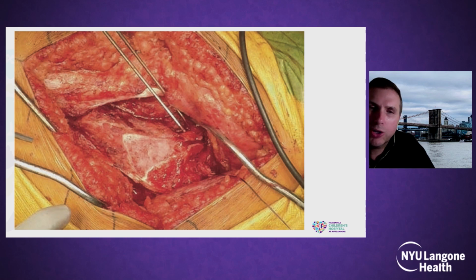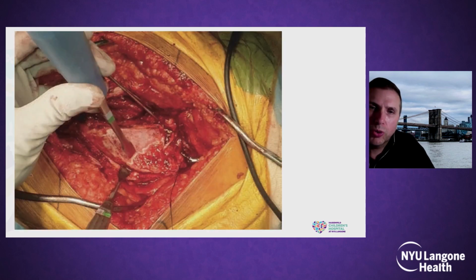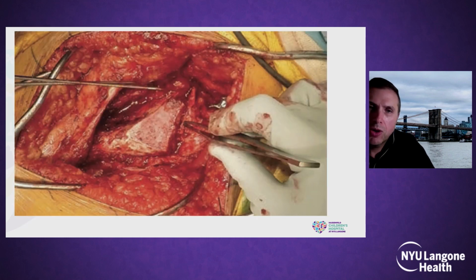And by doing that, you expose the greater trochanter. By leaving the piriformis intact in its insertion into the greater troch, you can develop this plane and develop almost like a banana peel up the femoral neck to allow the vascularity to the femoral head to be preserved, while allowing this whole piece to be mobilized.